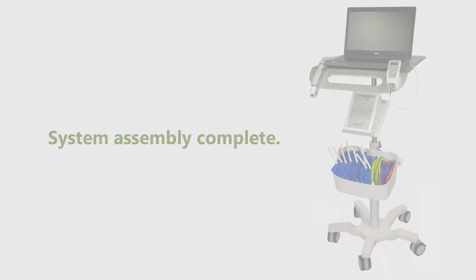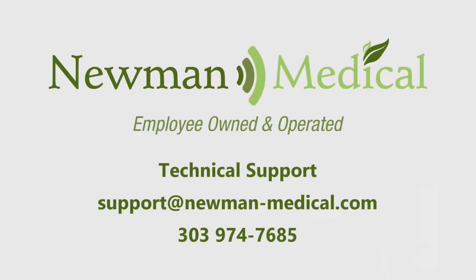Your simple ABI system is now assembled and ready to perform its first ABI exam. Be sure to refer to your owner's manual.